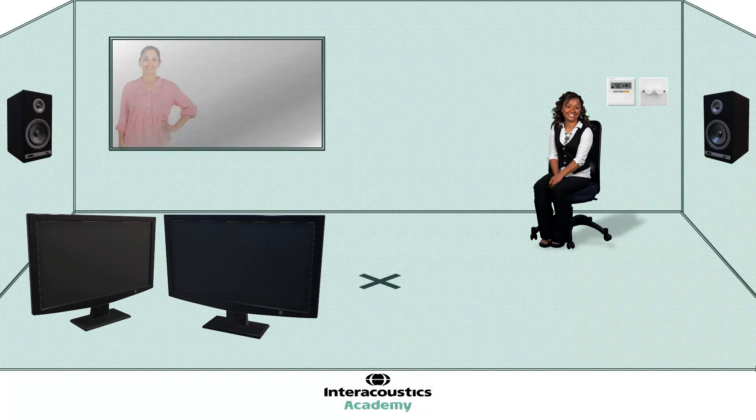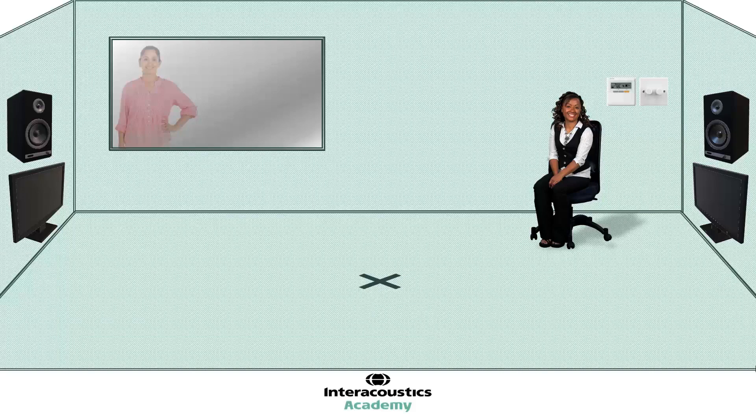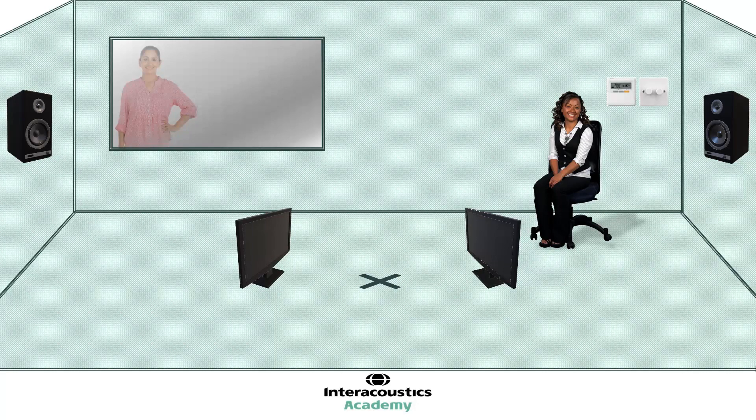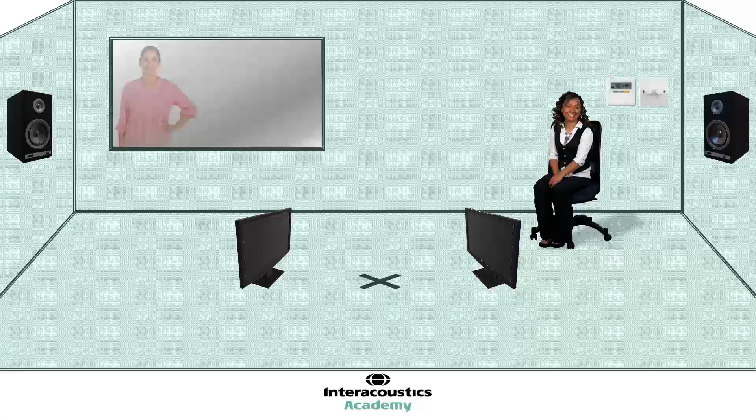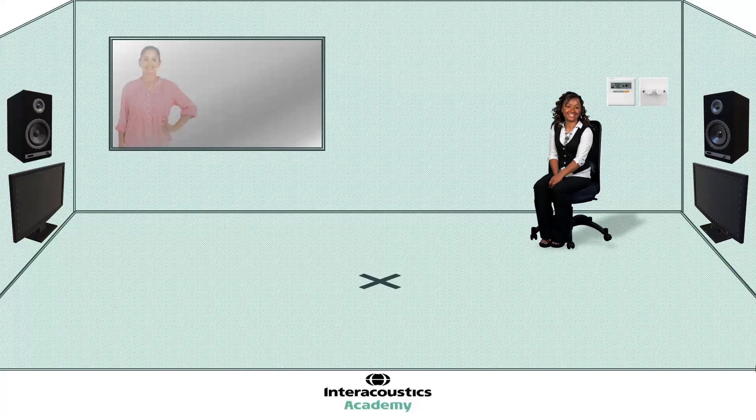Next, we require our visual reinforcement system, which could be a toy box, or in this case, a digital screen system. Ideally, the visual reinforcers should be located as close as possible to the speakers, and in line with the patient's head, in order to elicit the strongest and clearest head turn and to help with ongoing reinforcement. A really nice option to have available is the ability to move the reinforcers closer to the patient in case there are any issues with vision development. This is also very useful for the youngest VRA patients. Mounting the reinforcers on moveable brackets or a stand with wheels are two good options here.